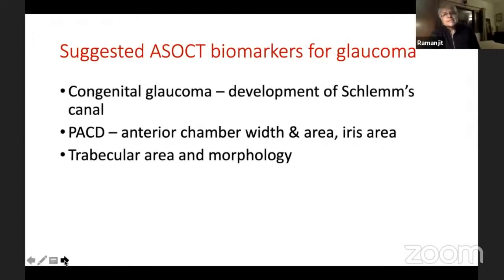It is also suggested that you can use an anterior segment OCT at 1 month after surgery, and that would help you to decide, no, this patient needs additional mitomycin C or additional steroids, or you can stop the steroids, or you can do some needling for the bleb so that you get good long-term results with your trabeculectomy.